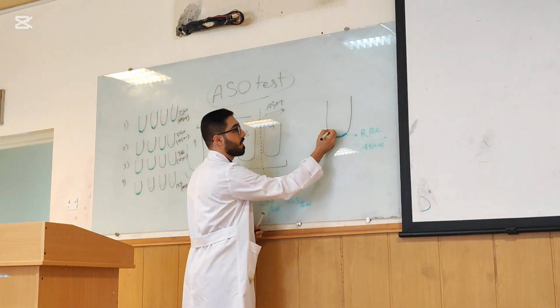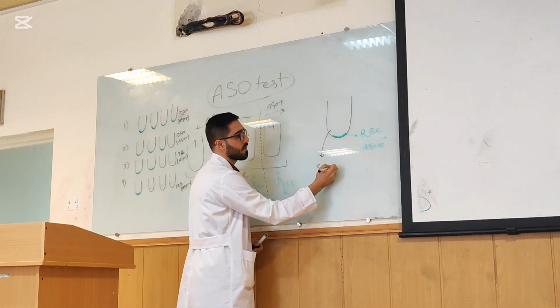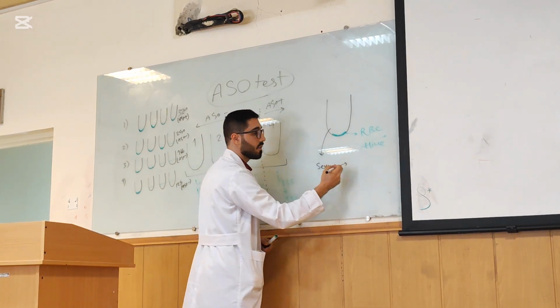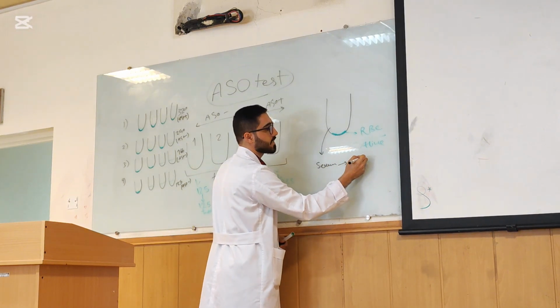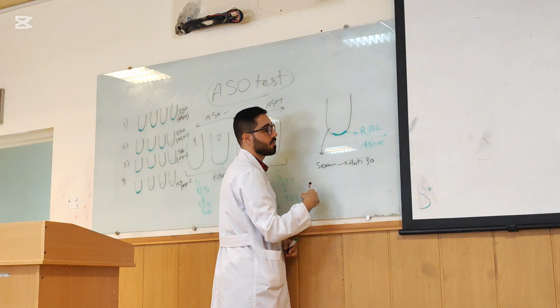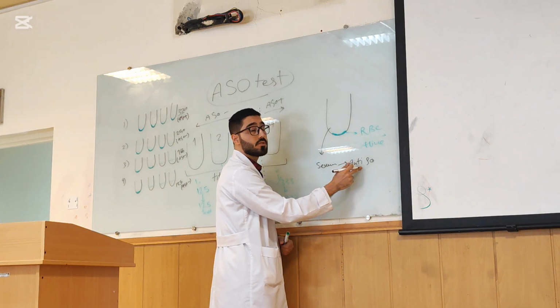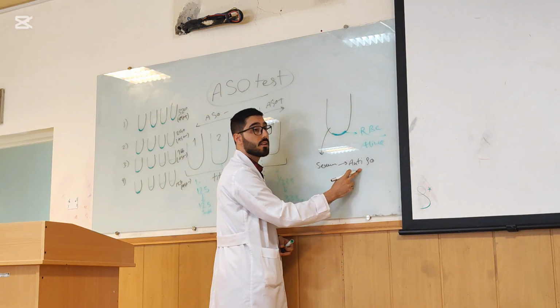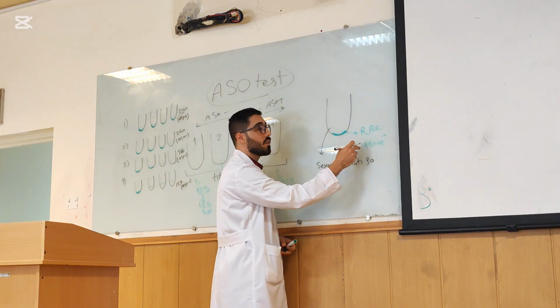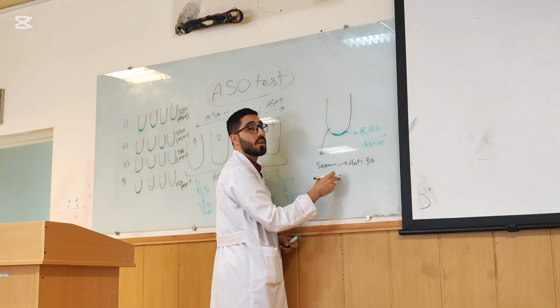Why? It means my serum has anti-streptolysin O, anti-SO, and this antibody neutralizes the antigen. Because of that, SO does not attach to RBCs. It's not good, it's unhealthy.